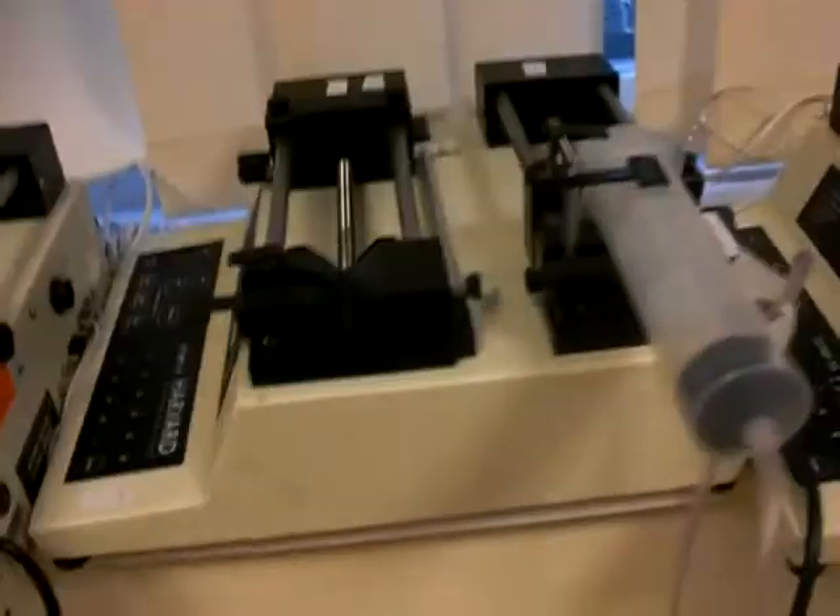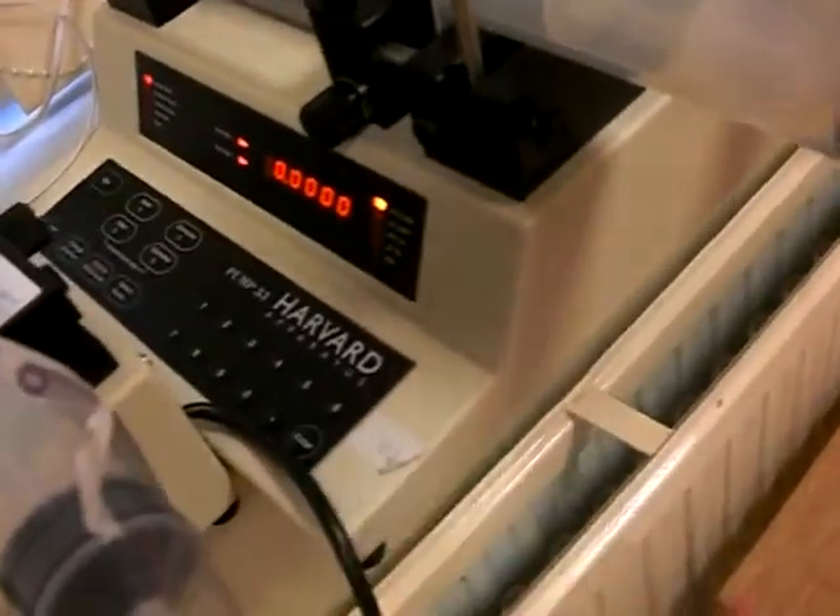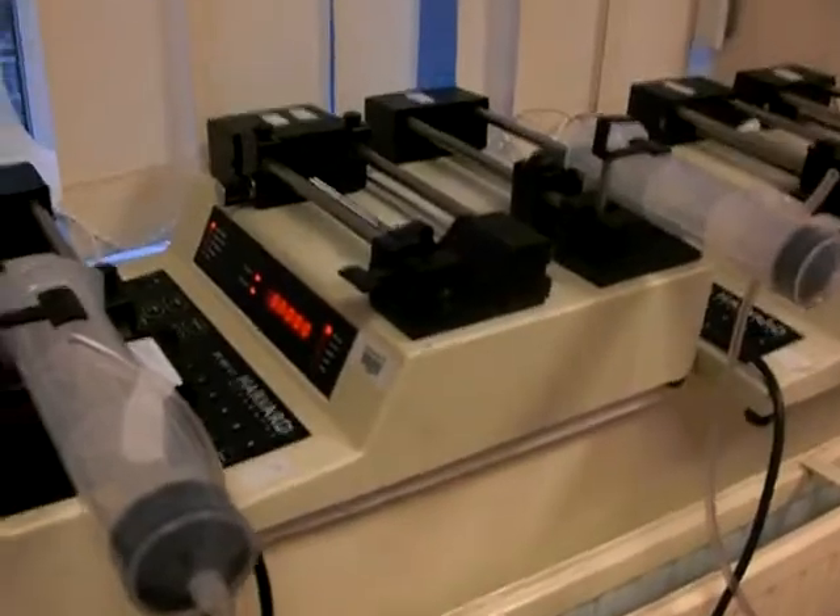Now I'll go into the pumps themselves. I've already switched them on at the plug. Switch them on using the back button. You'll notice that all the pumps are flashing. We first of all need to stop them doing that, so just press enter on each pump. The computer has to send each of these pumps instructions individually, so we need to tell each pump what number it is.